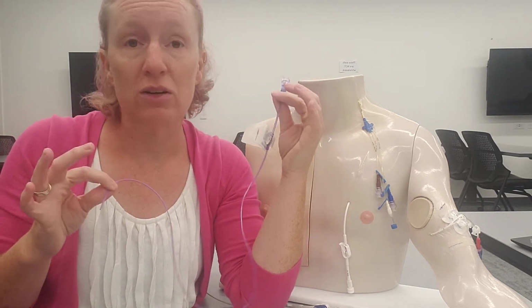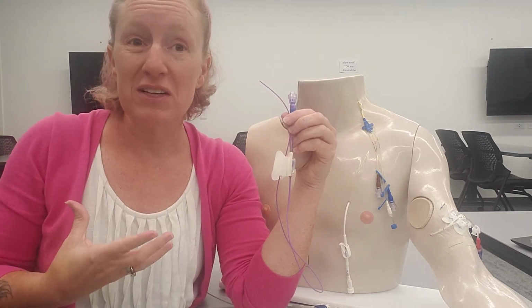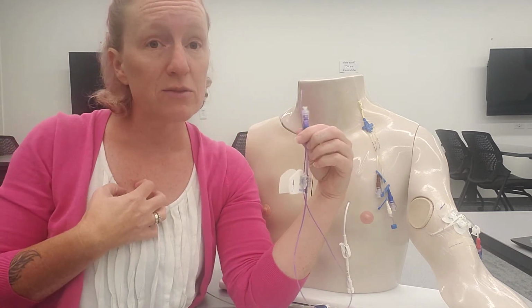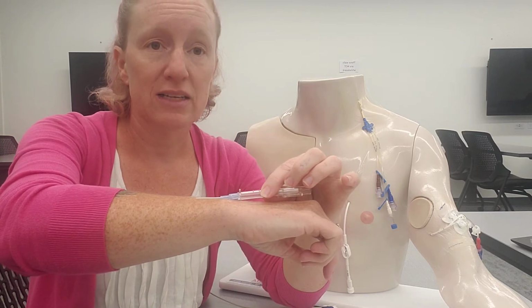cava, which is really great for when we want to give some pretty concentrated medications or some pretty hard medications, to have it in that big space so that it's diluted really well. Also giving our vasopressors or any of that kind of stuff where we have to keep tabs on whether that medication is being effective or not for the patient. Really great to be in the central space. But for things like fluids, maybe some Zofran or some morphine, a peripheral line is just fine.